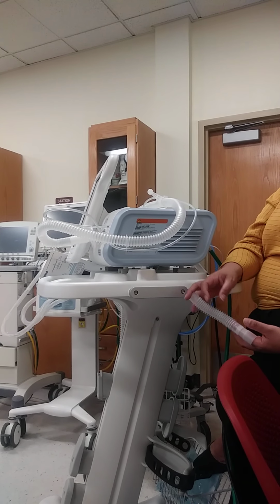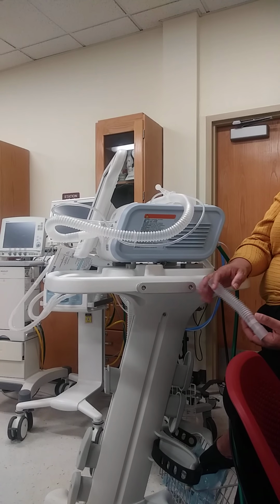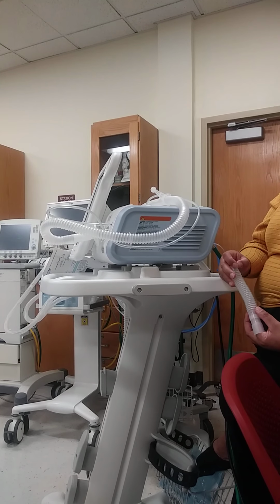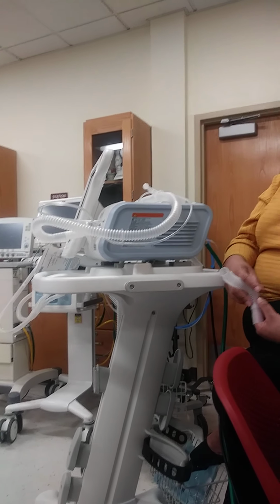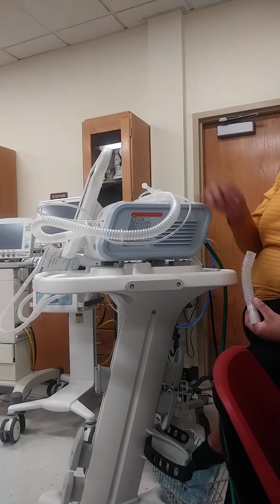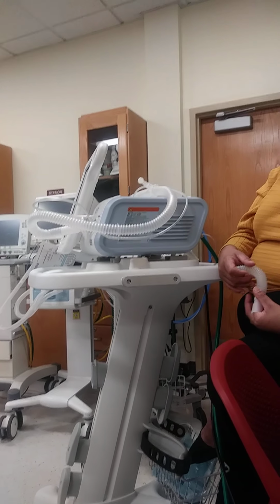The CPAP just did not cut it, so they need a BiPAP, because the BiPAP has two pressures, and I can also set a backup respiratory rate to help them. The CPAP does not have that. The CPAP is just one pressure regardless of whether they inhale or exhale. So this is a little more detailed, where I can fine tune and help their breathing.